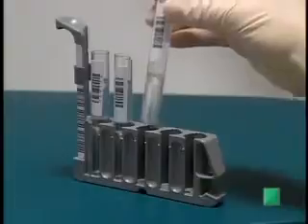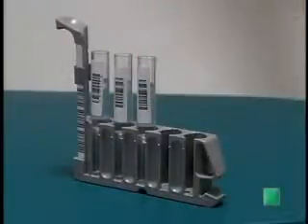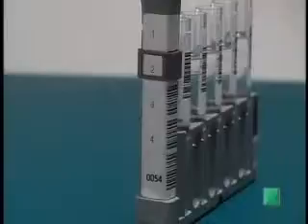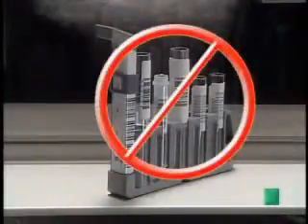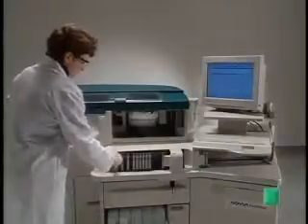Place the sample tubes or cups in the rack with barcode labels above or between the slots in the rack. Move the tube type selector to the position for the tube type you are loading in the rack, and as defined at the Setup Tube Type and Barcode window. Ensure to place only one type of sample tube or cup in the rack, which corresponds to the tube type selector. Load one or more routine racks in the sample entry queue.